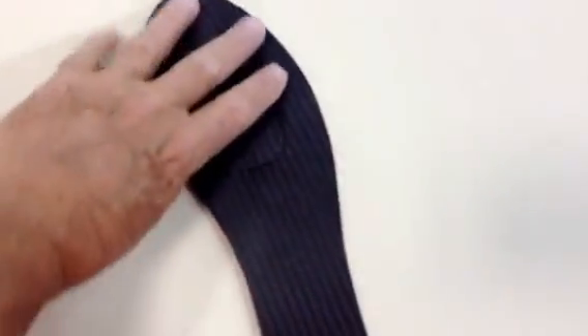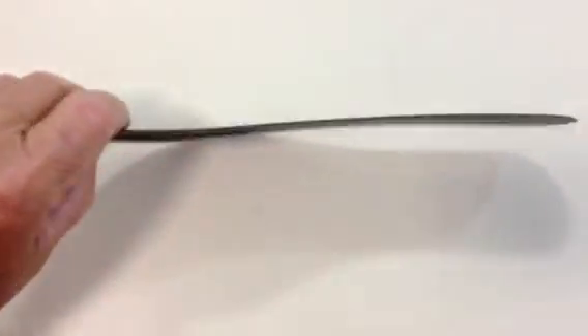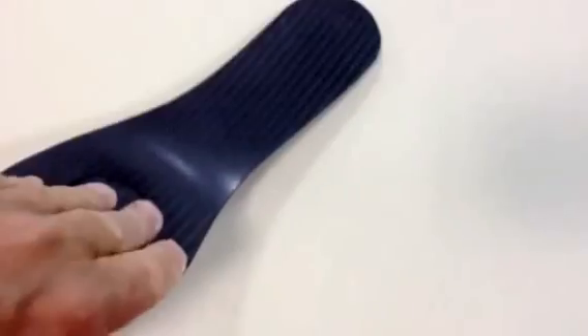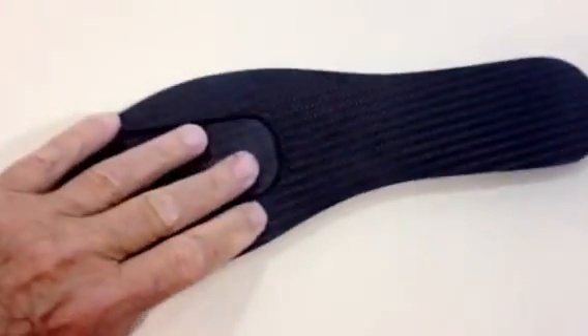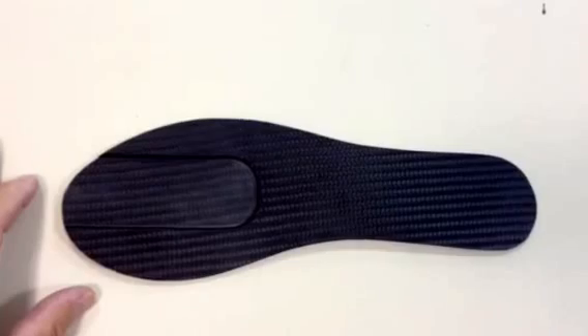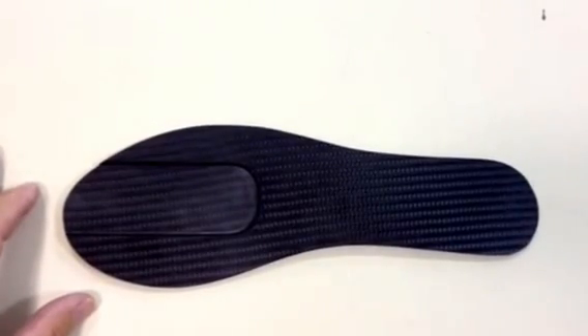Super lightweight, very low profile, 41 thousandths of an inch thick, flexible in all planes. Super light — 0.07 ounces.